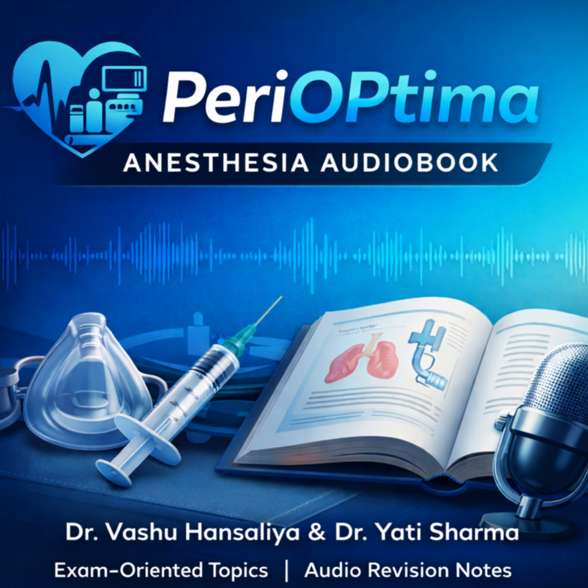That's bad. But far worse, you might occlude the left vertebral artery, which comes off the subclavian, and that compromises blood flow to the posterior brain circulation. A stroke. And if you're too low, you cover the renal arteries. You turn a cardiac failure patient into a renal failure patient instantly. So the placement is non-negotiable.